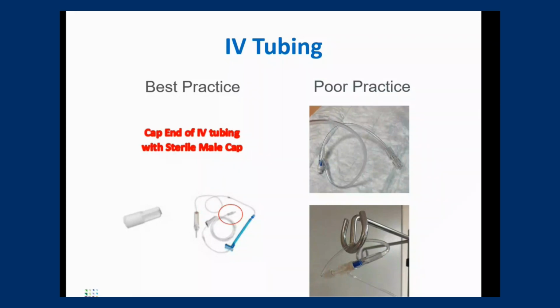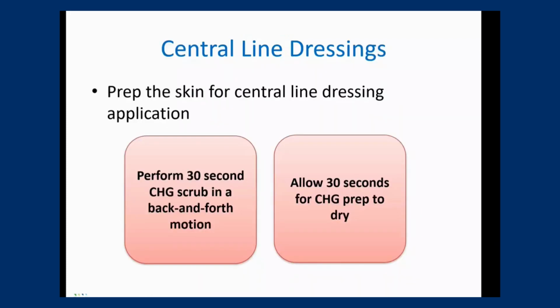Another poor practice is going to be that photo below, where it's looping that line around into a dirty connection. That was another instance where you would be throwing everything away. On the left-hand side, we have our best practice, which would be to use the white sterile caps that are stocked on the floors anytime you need to disconnect and then reconnect the same line.